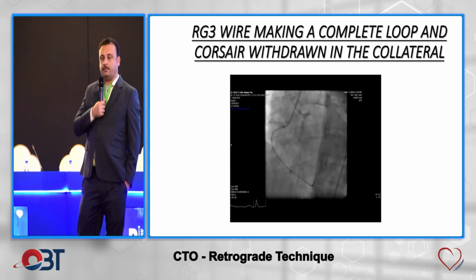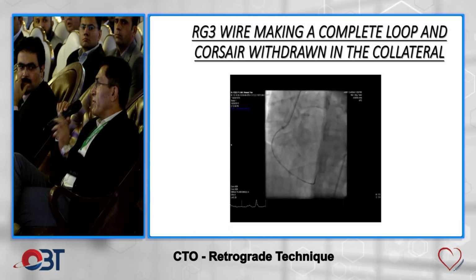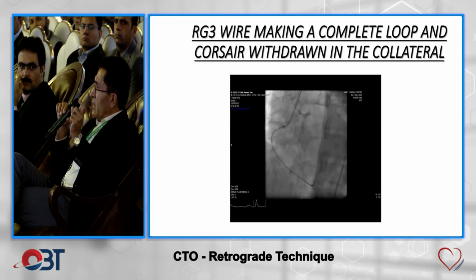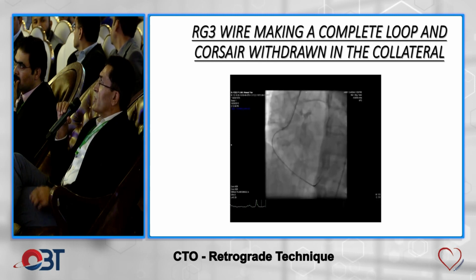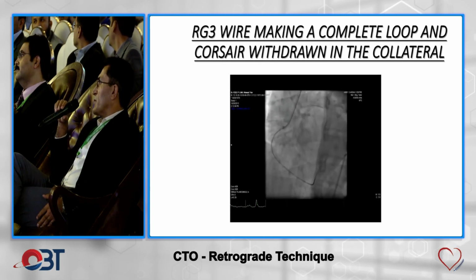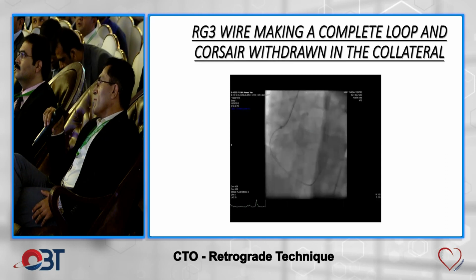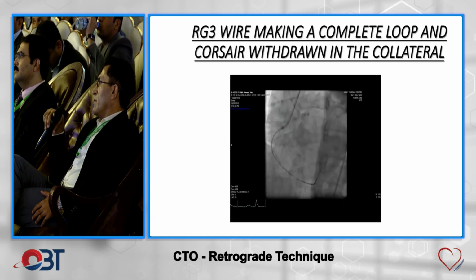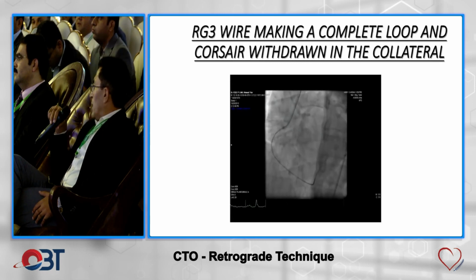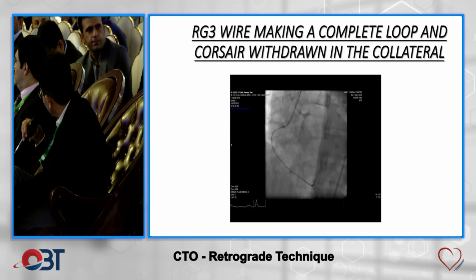Sir, I just want to ask you guys the question: do you take help of imaging before embarking on such a procedure at times? CT angio? Yes, CT angio can be helpful at times. Yes, it does help at times, and if it's a long CTO, doing a CT angio beforehand can be very useful. Sir, Dr. Salman, how often do you do CT for such patients before?